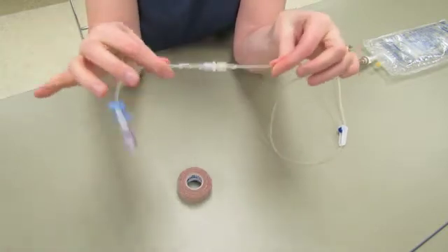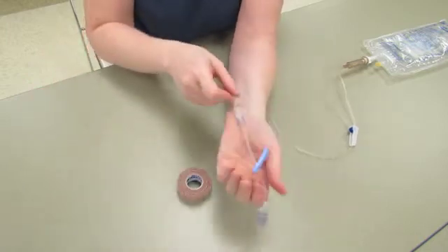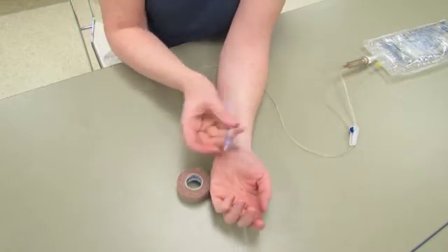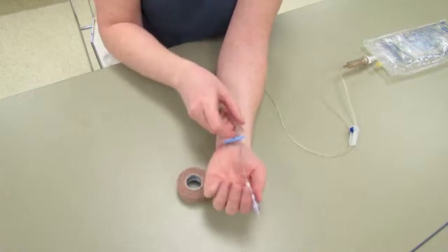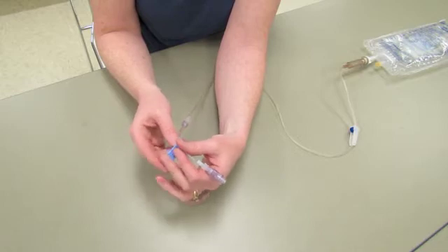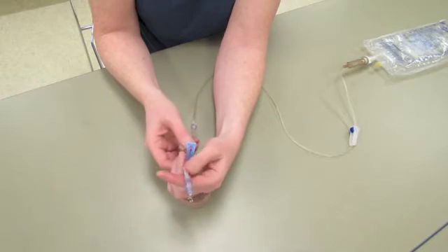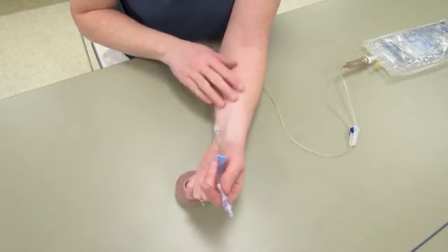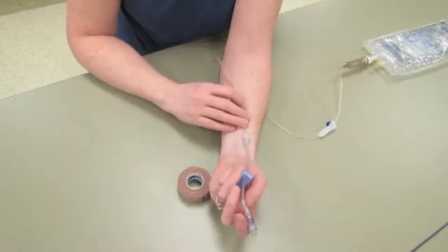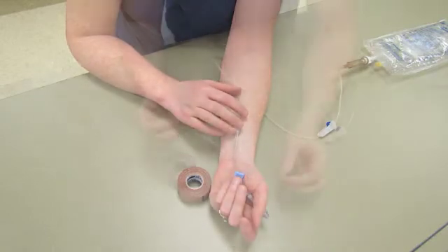And this is a leak-proof system where it's realistic in that the students would put the medication into the port just like they normally would. They can flush it with any medication. You don't have to worry about what type of solution you're using, whether it's glucose or normal saline. The glucose will not grow stuff because it's in the mannequin veins, because it's not running through them, it's running parallel to them. And you don't have to worry about salt crystallizing from normal saline solutions either.